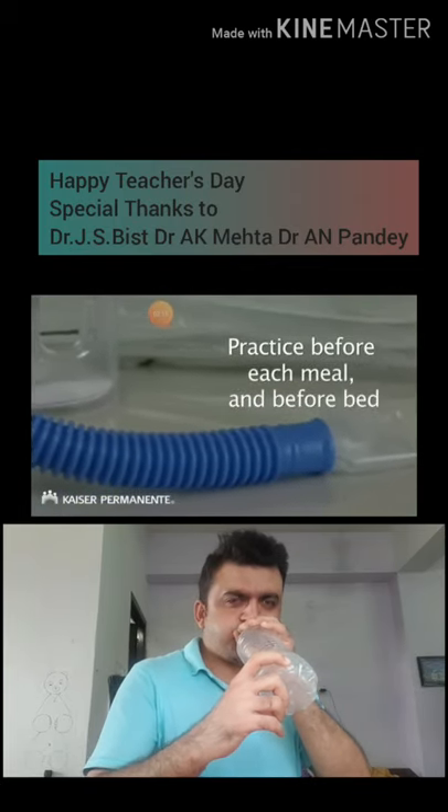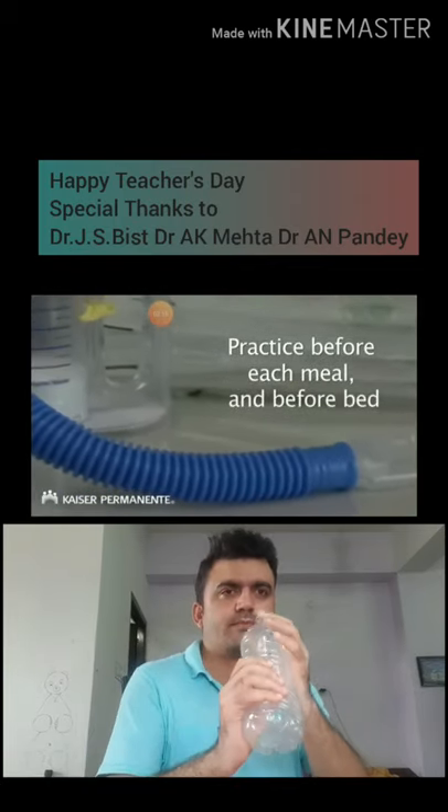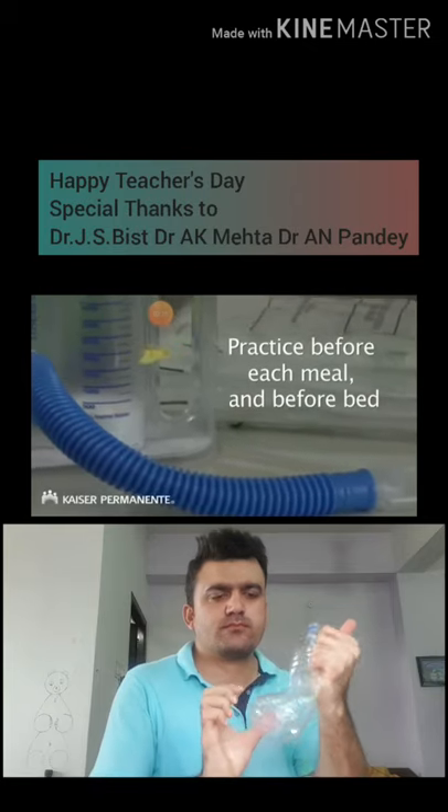If it helps you remember, you can practice using your incentive spirometer before each meal and then again right before bedtime.